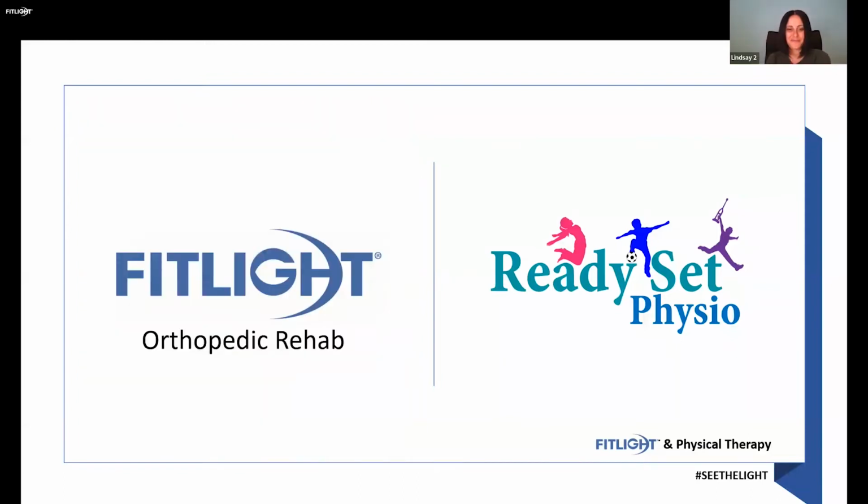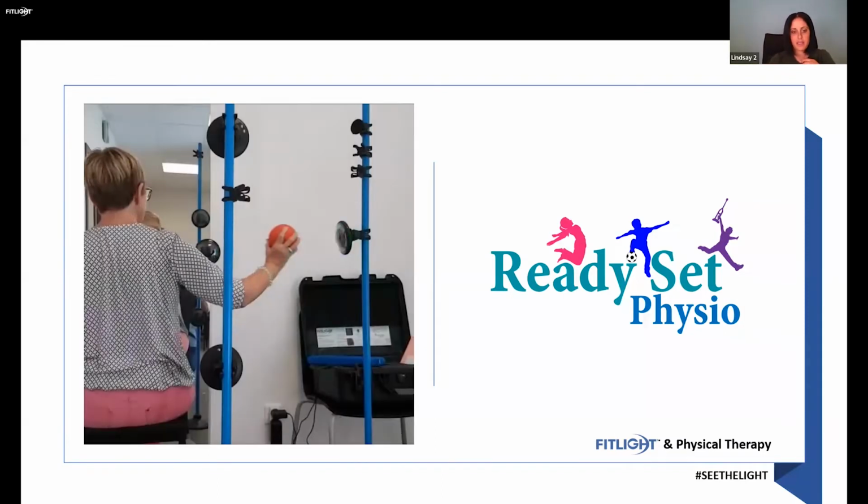You're welcome. Let's go to the next set of patients, if you will, orthopedic rehab. Just your general orthopedic clients, so your hips, your knees, your shoulders. For this group, we just chose one video for shoulder rehab. We'll show you the setup, and I'll talk a little bit about how you could change this up, or how you might use the lights in a different way.